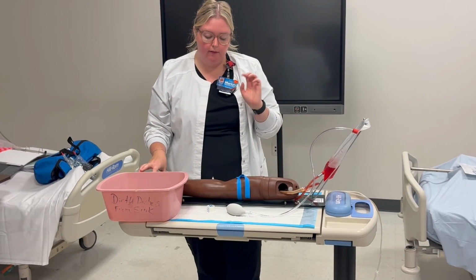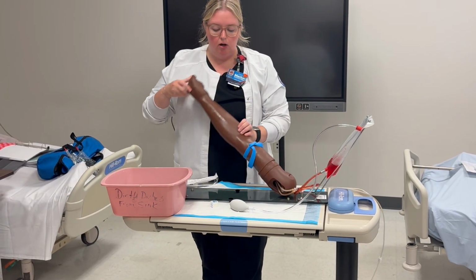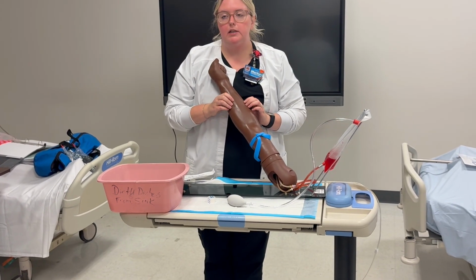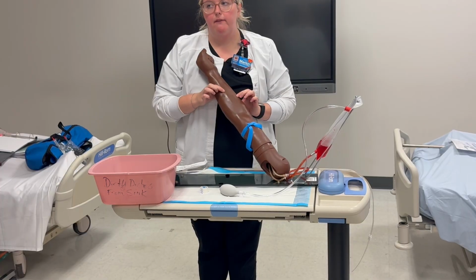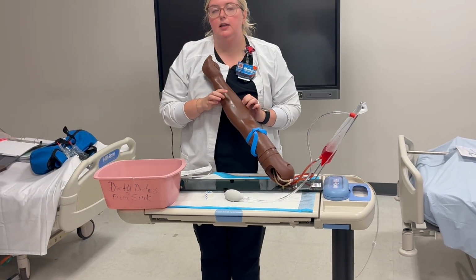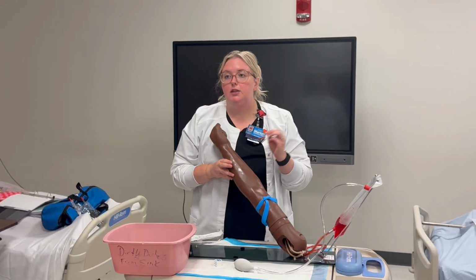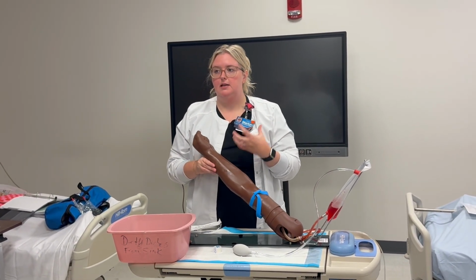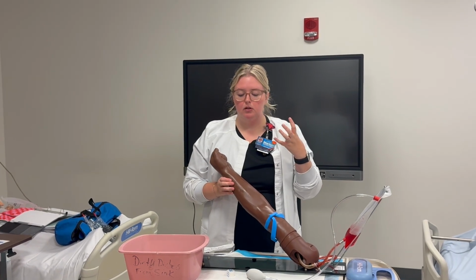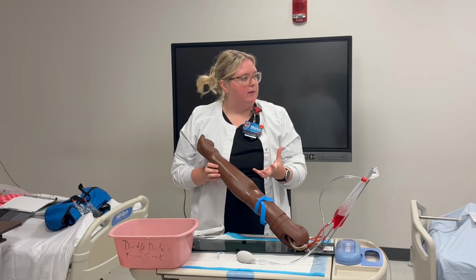Okay, so I've got my tourniquet on. I'm palpating a vein. When you get your arms, you're going to see some track marks because we reskin these once a year. You feel the bounce, but this does not feel like a real patient. And like I was mentioning before, the premise of the skill is not to get the IV, it's that you know the steps, you know what asepsis is, you know what to do, and you know when you did or didn't get it. Does that make sense?